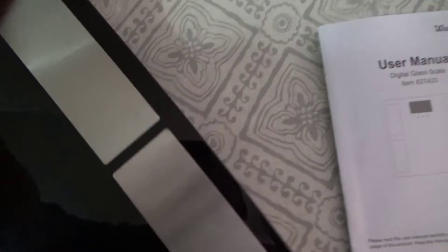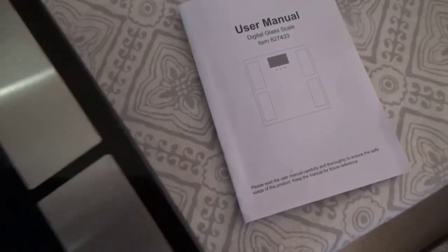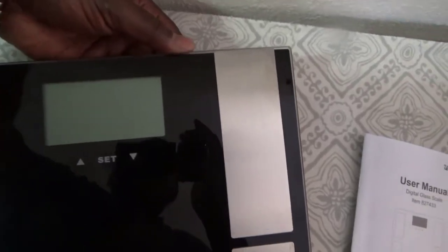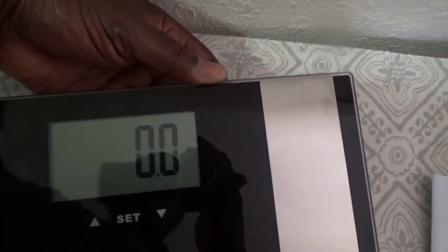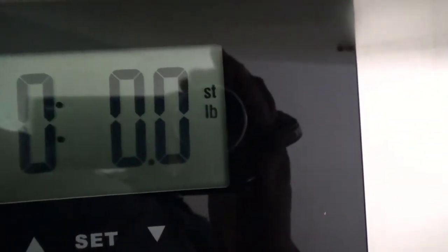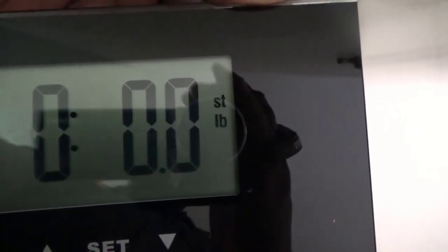We're gonna turn it over and I'm gonna reach on the backside and push the button once. That's gonna turn it on. Push it again, it's gonna display kilograms. Push it again, stones. Push it again, pounds. So every time you push it, it goes from one category to the next.